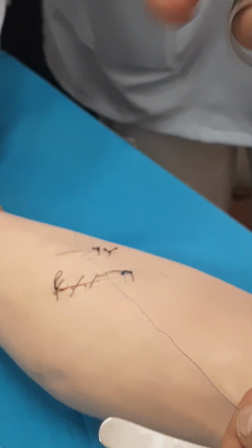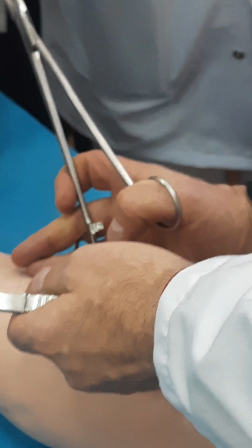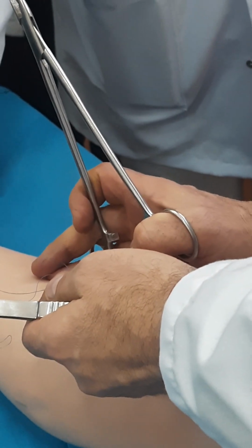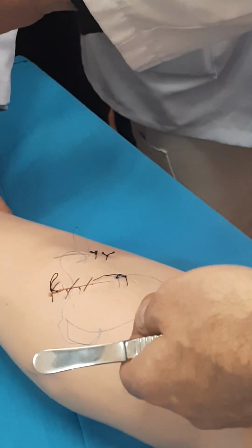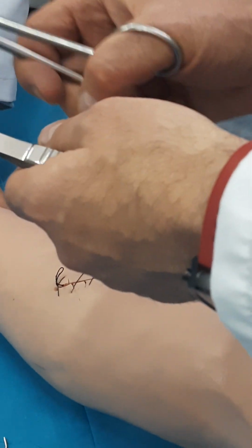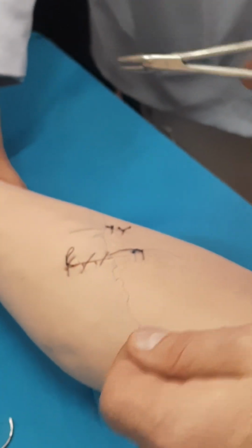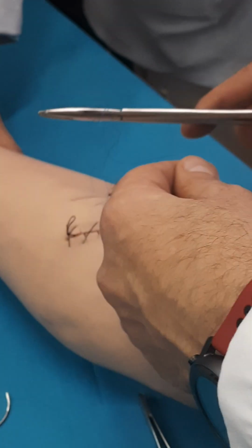Anyhow, I can do it by instrument. I can do it by hand. Everything is connected. How hard is it to connect the margins? If it is hard to connect, it means the margins are far from each other. Then you will use the hand technique, because with the hand technique we work under tension. Then you make the knotting by instrument. Look, I make the knot. It is, by the way, surgical. Look at it, twice I turn it.